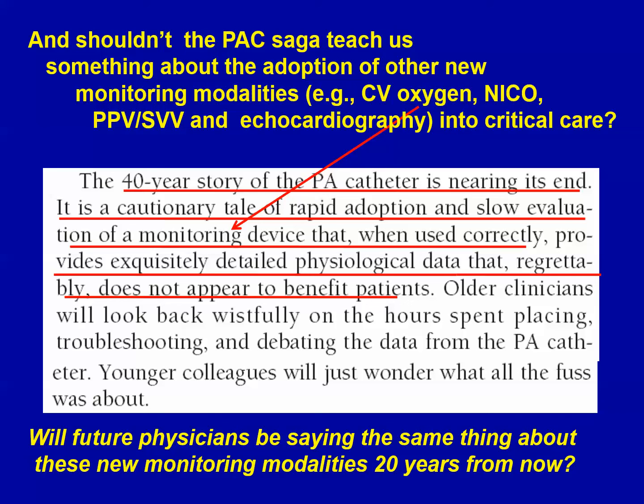Shouldn't this teach us something about the adoption of other new monitoring modalities, such as central venous oxygen, non-invasive measurements of cardiac output, and echocardiography in critical care? Will future physicians be saying the same thing about these new monitoring modalities 20 years from now that naysayers are now saying about the pulmonary artery catheter?